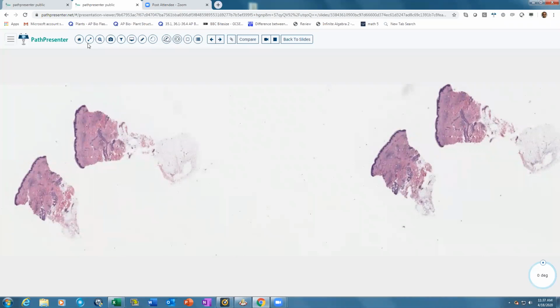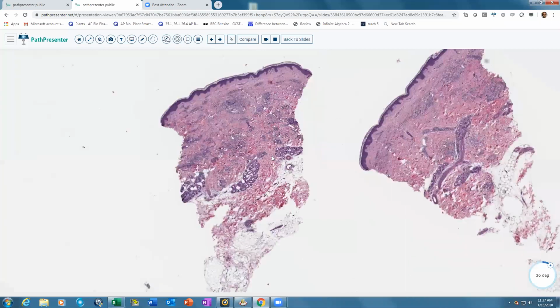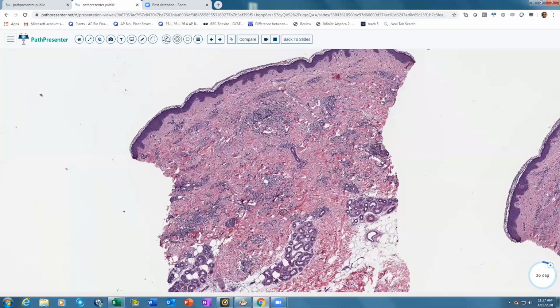Granuloma annulare is a very common cutaneous manifestation that you're going to see, and histologically it can present with either that palisaded granuloma that you saw, or other variants that you should be aware of. One is known as interstitial granuloma annulare, where there's a lot of inflammation. So it's called a busy dermis. There is a lot of action happening throughout the dermis. Vaguely, there is some palisade formation, and if you do mucin, you're going to see pools of mucin scattered throughout these infiltrates. So it won't be diffuse, but pools of mucin scattered throughout the dermis.